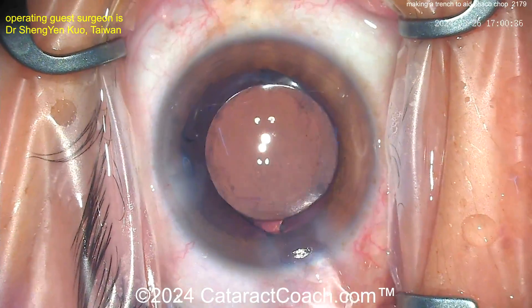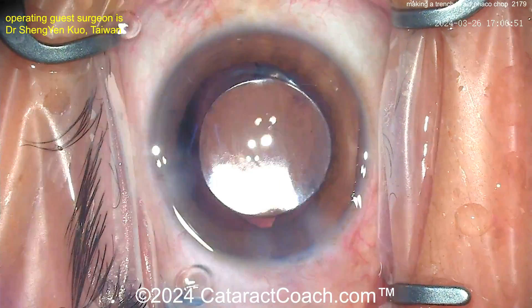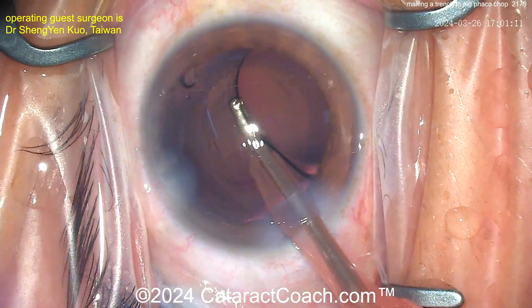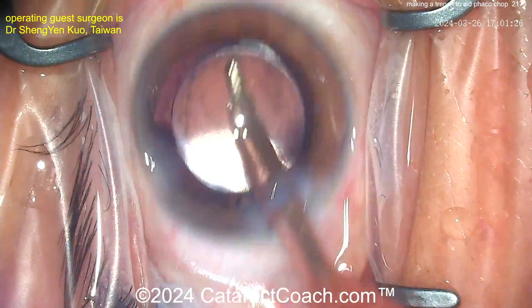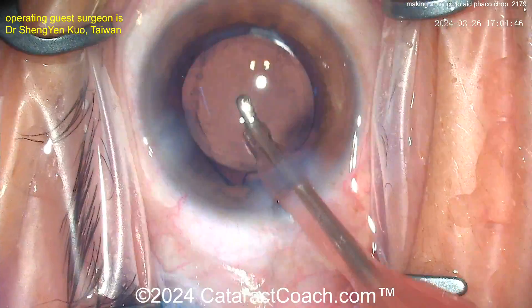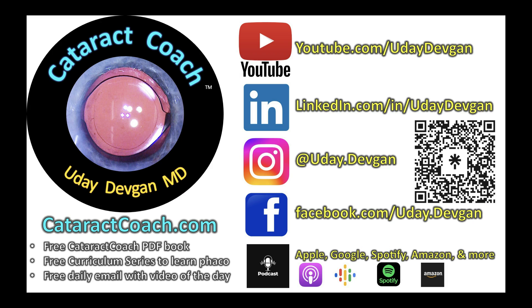Beautifully done — I like everything about this case: the technique, the incisions, the draping, the rhexis. Look at this — sealing up the incision nicely. Using the I/A probe behind the optic to remove viscoelastic. Loving this case — fantastic job, Doctor! Thank you for submitting that video. Remember to check out CataractCoach.com and the new podcast every week, where we talk to a surgeon for about an hour — great insight that will improve your practice.